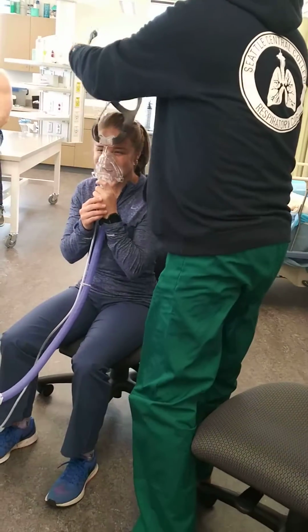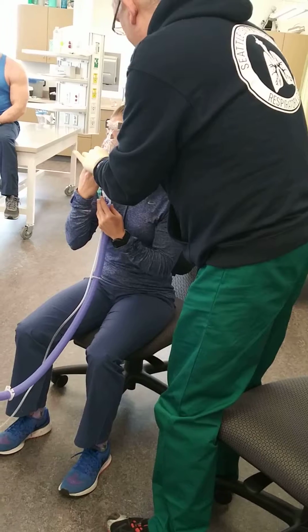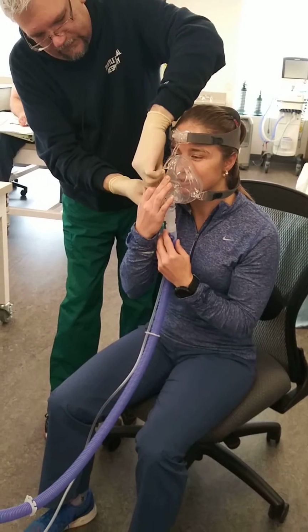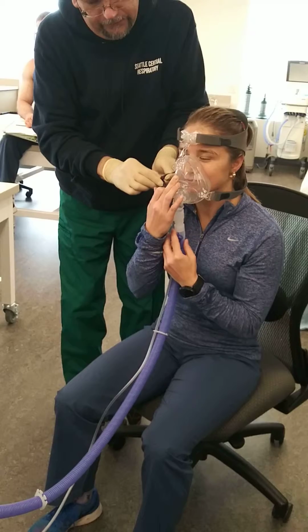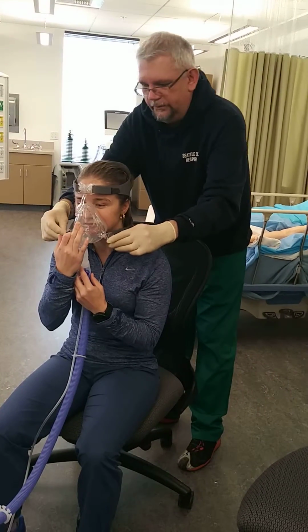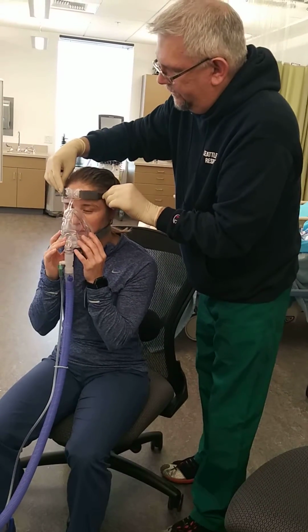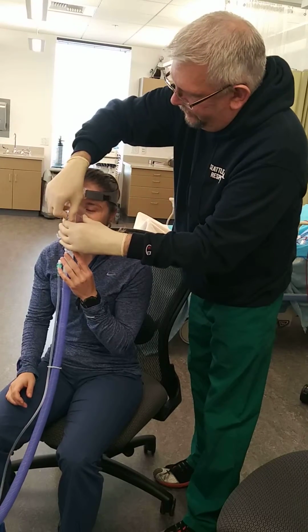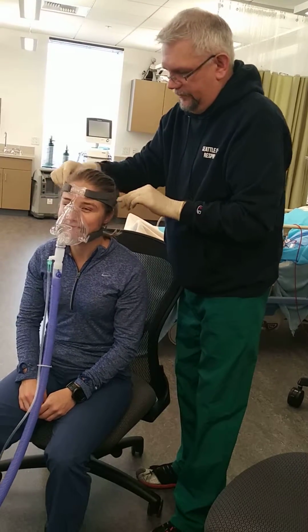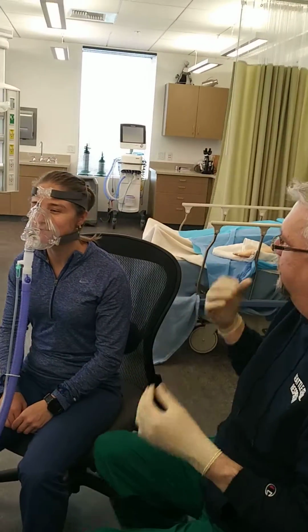So this goes along behind your head, and then this clip comes around this side, and this clip comes around on this side. And then what we're going to do is I'm going to just real slowly kind of pull these taut. And then like so. And then I might adjust. There's a couple of ways to adjust this. So clip that in there. And then I'm going to pull that up to your forehead. Does that feel okay? Yeah. Not too tight? Okay. So yeah, you feel like it should just kind of sit there.